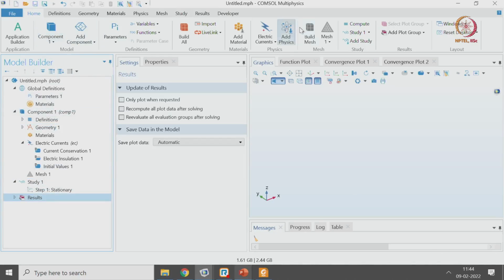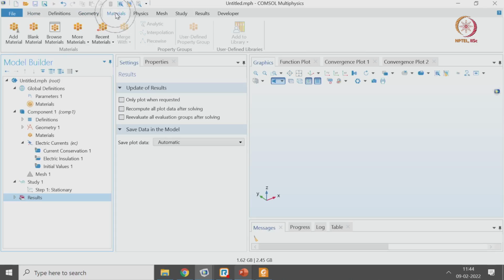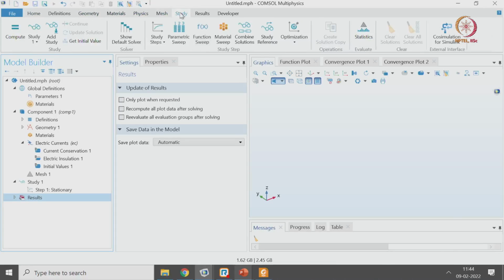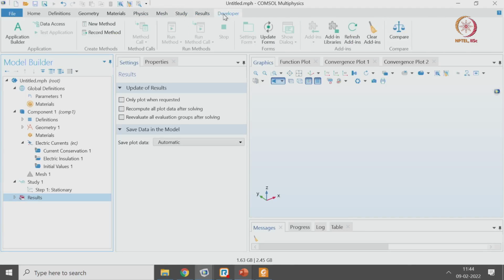The top section is the ribbon pane that you see at the top, and the approach in the ribbon pane is also the same: you first make the geometry, then add the materials, apply appropriate boundary conditions, mesh the geometry, perform the study, and finally post process the results. There is also a developer section over here that you can use to write your own scripts and code and couple it with your model.